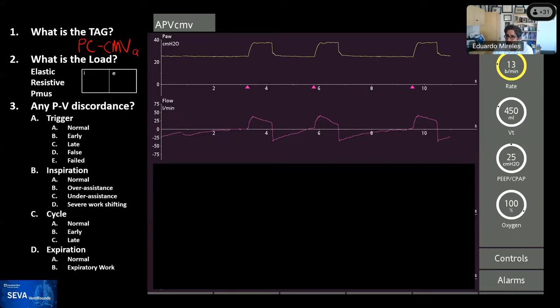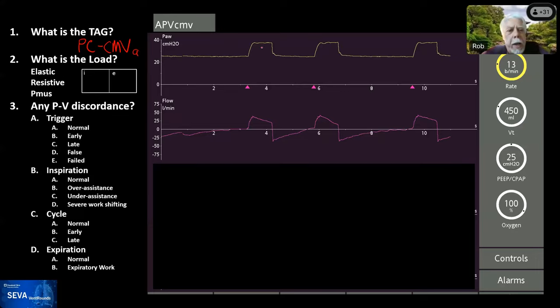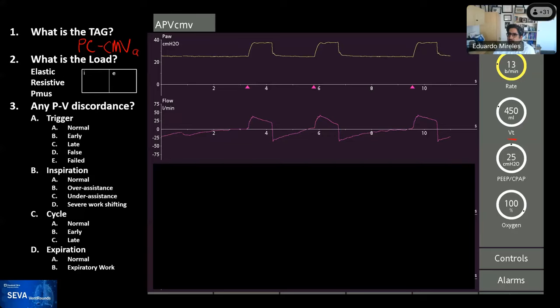Rob: just to reiterate that you can't tell by looking at the waveform alone that this is adaptive — you can tell from the name 'adaptive pressure ventilation.' But more specifically, on the right you see the ventilator control settings: you set a tidal volume in pressure control, which can only mean adaptive targeting. Eduardo: That's the perfect point — just looking at the waveform, you cannot determine the targeting scheme, especially with a paralyzed or deeply sedated patient. The waveforms will be very difficult to interpret without knowing the targeting scheme or breath sequence in the absence of patient effort. That's the importance of knowing the TAG of the mode you're using.